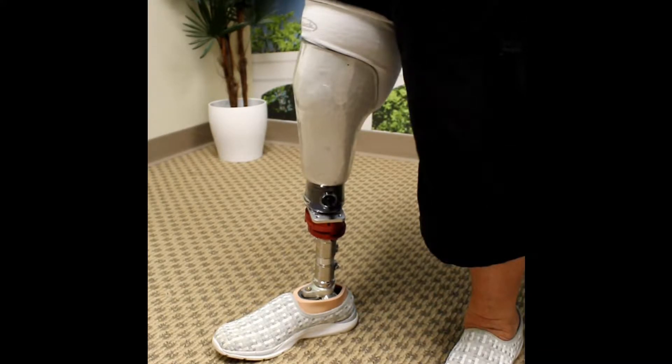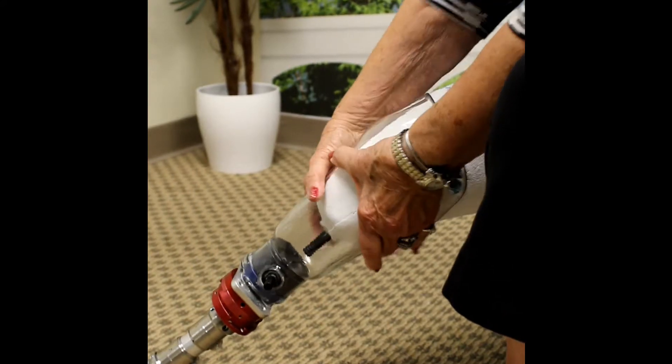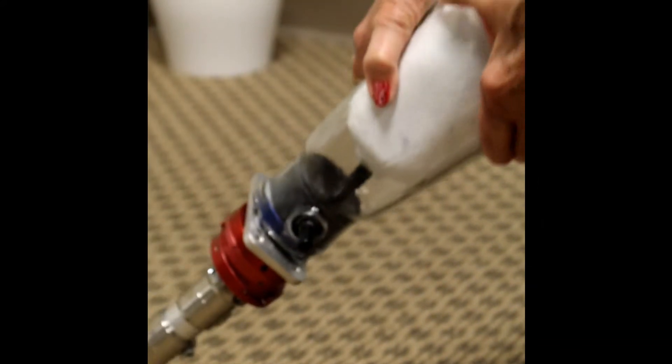If you have too few socks, the prosthetic will slide on relatively easily and likely be painful during use. If you have too many socks, the prosthesis will be painfully tight and you may not be able to get any or all of the clicks, as demonstrated here.